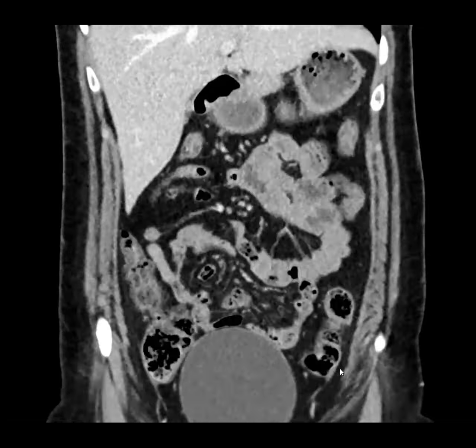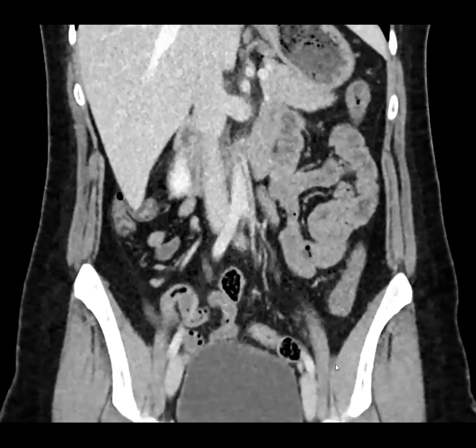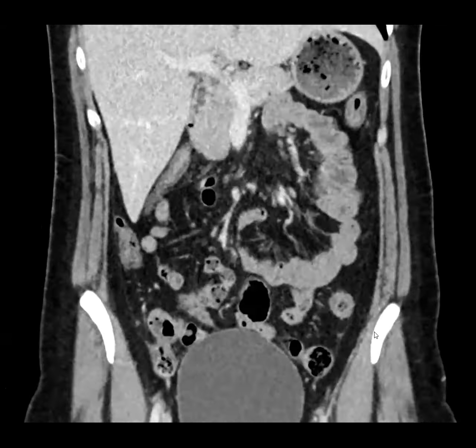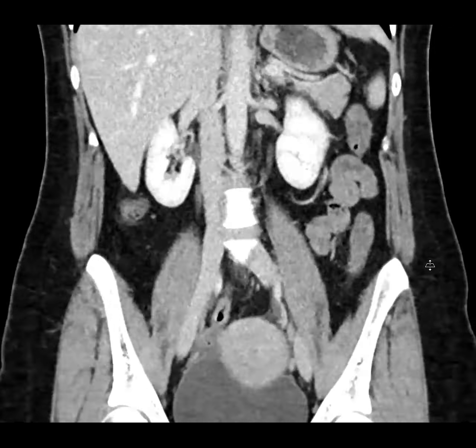And my gastroenterologist said to me, why did you guys say no evidence of ischemia? I think this could be ischemic colitis. And we said, well, the vessels are all open, we don't see any additional findings. But anyway, they went to colonoscopy and did biopsies, and this was actually severe ischemic colitis in a young female. It was a good teaching lesson for us: we think about ischemic colitis as a disease of older patients, where you're going to see more severe findings, but you can actually get it in young patients.